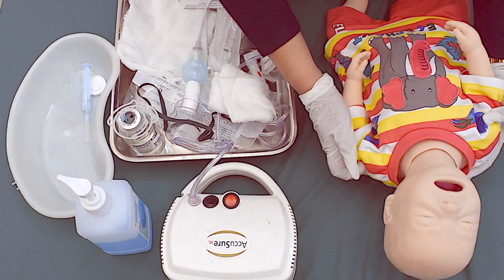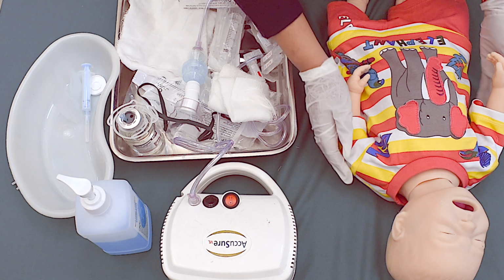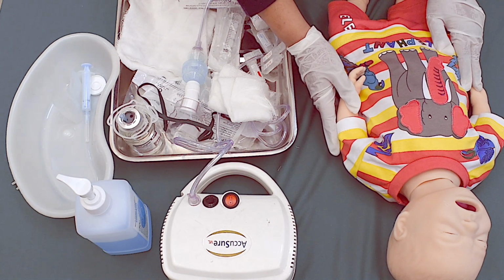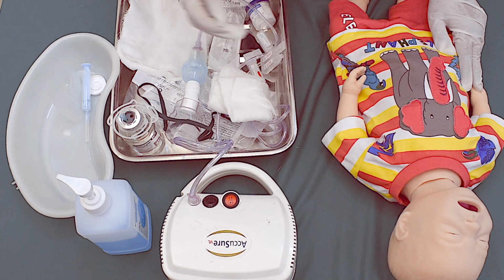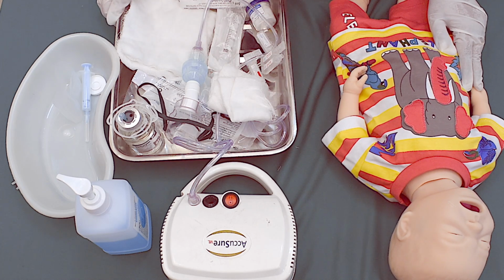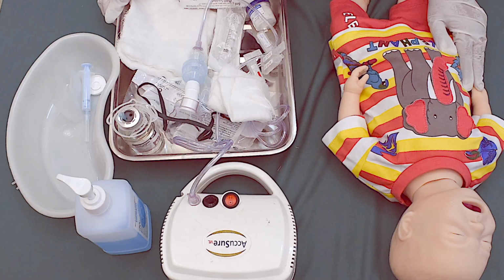After giving physiotherapy to the child, ask the baby or the child to cough and spit out and bring the secretions. Offer a sputum mug to the child or a kidney tray can be offered. Make the child comfortable and do recording and reporting of the procedure.